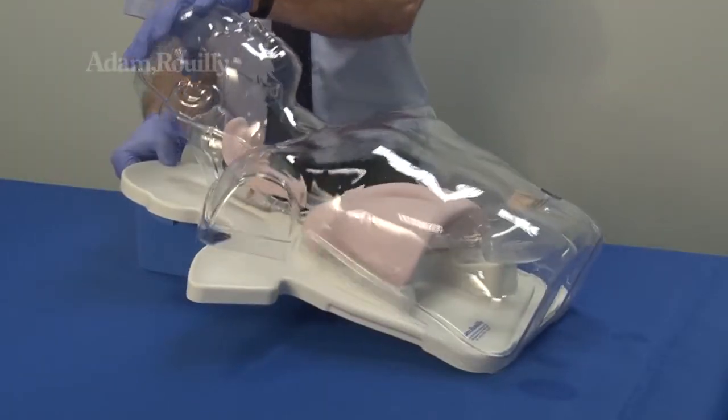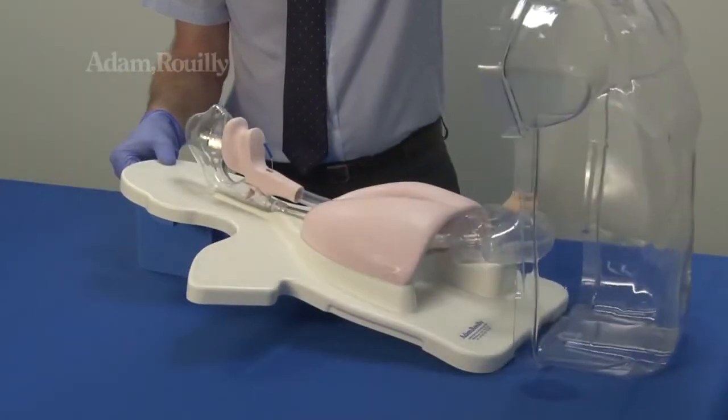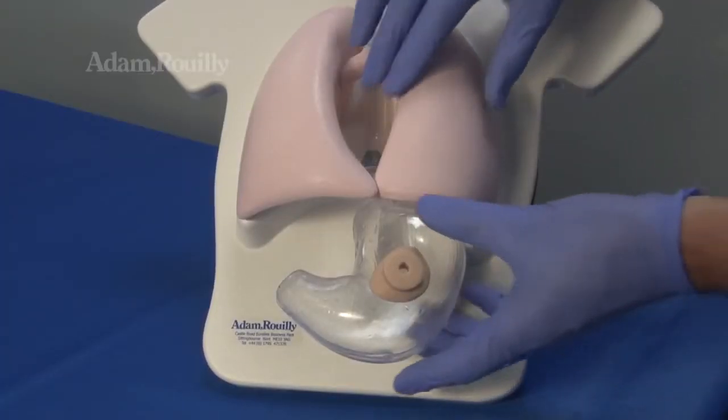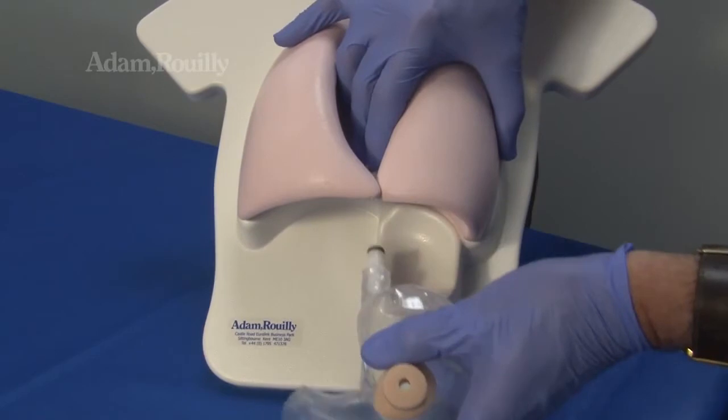After use: to clean or replace the stomach, remove the outer transparent cover. Press the grey quick release button on the connector and pull the stomach downwards to remove.